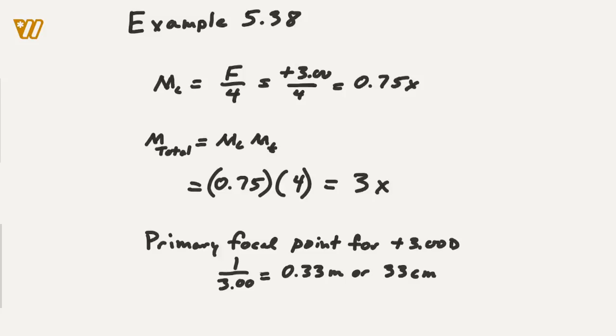All right, guys, let's keep on going. So what are some other uses of telescopes? Well, one of them is going to be spectacle mounted telescopes, whenever we attach a telescope to their glasses and have them wear those. So there's two main types here: center fit and bioptic fit. Now, the center fit, we think of it being right in the center of their vision, so it's going to be right in their line of sight.